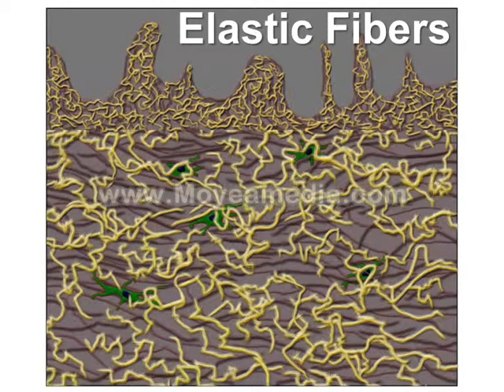Elastic fibers form a network that extends into the papillary dermis. Disruption in the elastic fibers would be typical of entities such as a scar and scarring alopecia. Elastic fibers are also displaced by melanoma, and that staining can be very helpful in distinguishing nevus from melanoma.